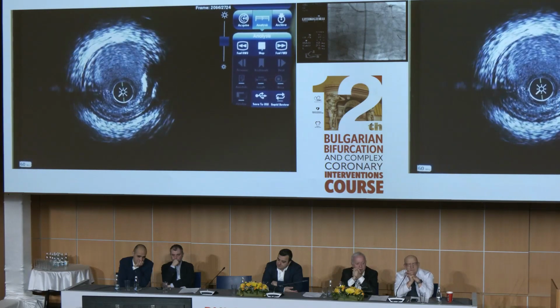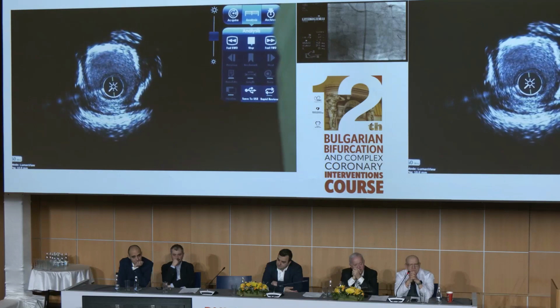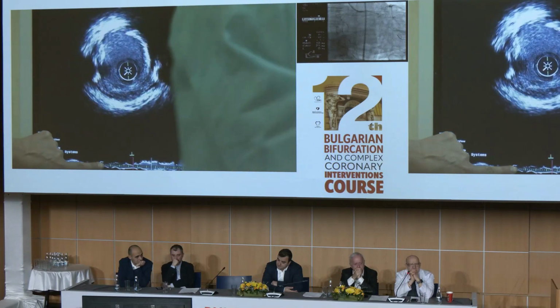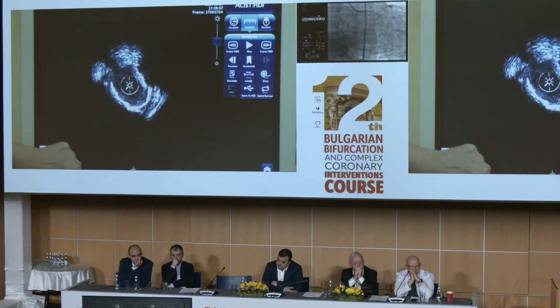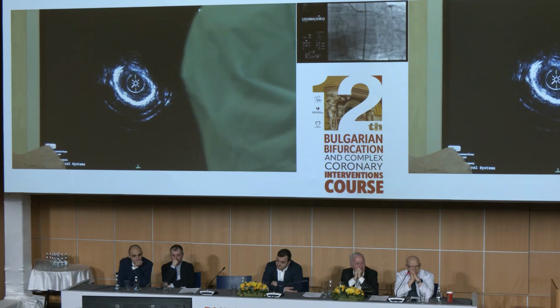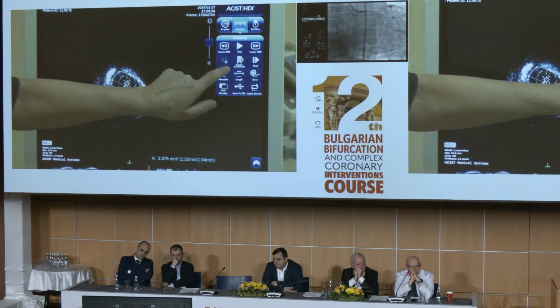Can we go back to the most calcified and severe stenosis on IVUS? Okay, we go back. Here. Maybe I'll remove the measurement.